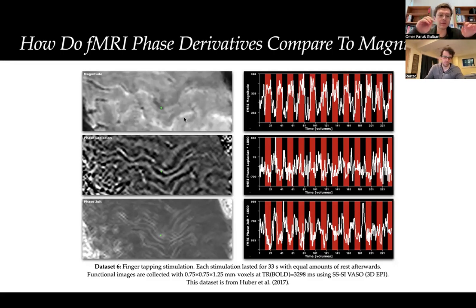I didn't separate gray matter or white matter. I think Tyler is highlighting that this voxel that I pick is just at a border between, let's say, a large vein and gray matter. Maybe during activity and rest they are moving a little bit, and this is somehow propagating to the phase measurements. Did I summarize correctly? Yeah. Just following up on that, does it matter also that the kernels of the second derivative are much larger, right? Because by the time you're doing the second derivative, you're walking out two neighbors. Exactly, it's kind of 5 by 5.